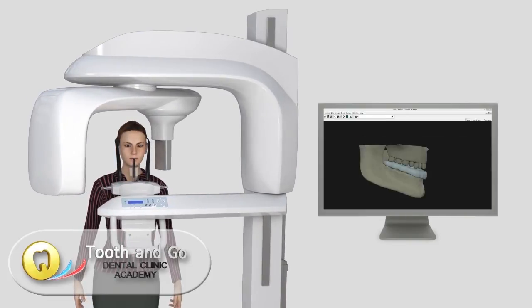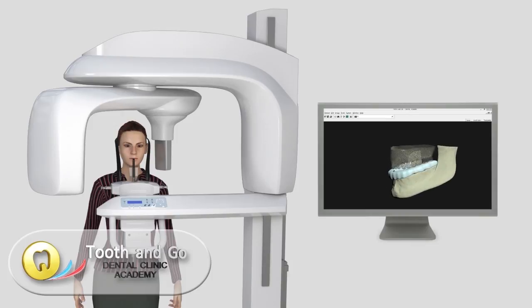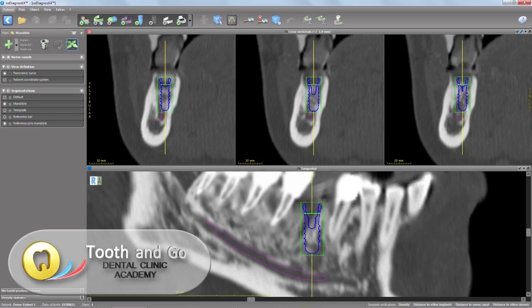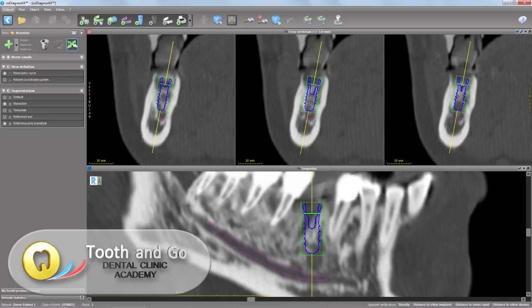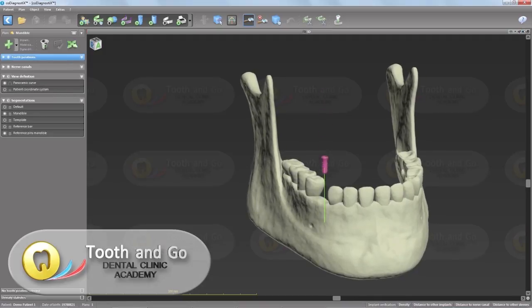The scanned files of the patient's arch will be integrated into our Co. Diagnostics implant planning software. The software allows us to virtually plan the implant placement.